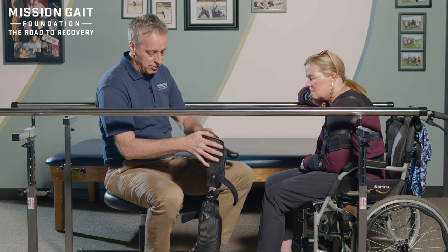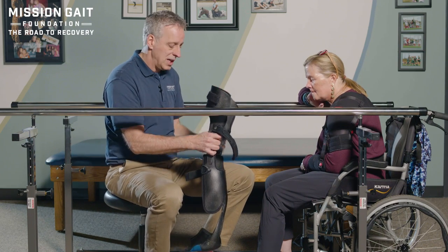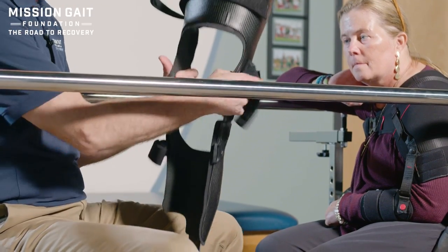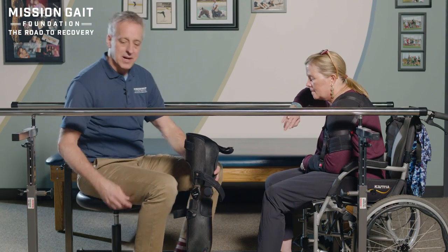So she understands how the brace works. It's velcro. Velcro is great in some ways, but of course it sticks to everything imaginable. You always want to take your straps and strap them back to themselves whenever you go to put the brace on. So the first time, I'm going to put it on for her so we can see how it fits, and then we'll move on from there.